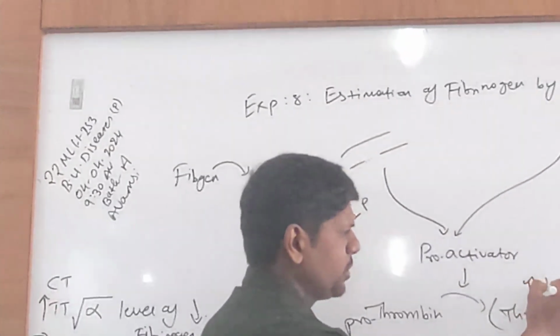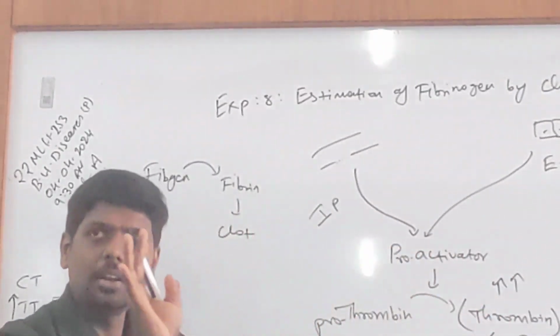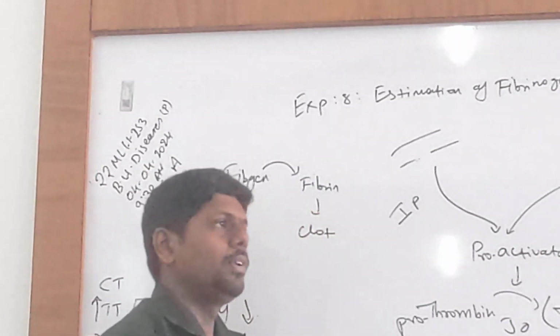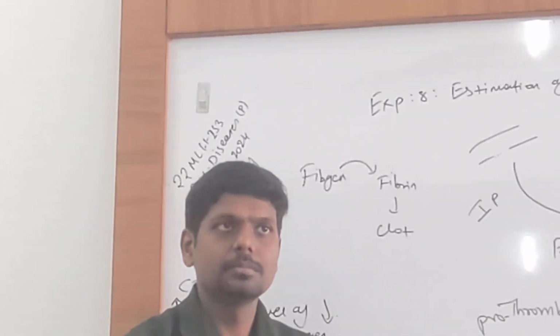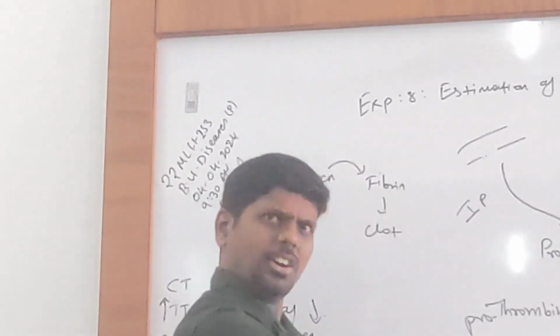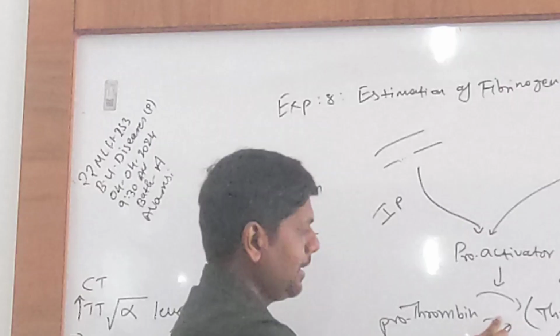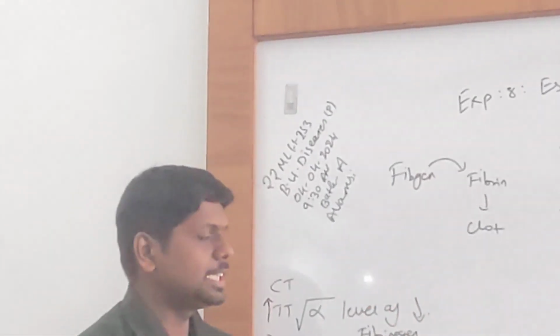I will take excessive thrombin reagent. Normally the ratio between these is 50% fibrinogen and 50% thrombin. Okay, now let me flip the story. In case of reduced fibrinogen levels, this will be 10 and 90. What happens in this case?